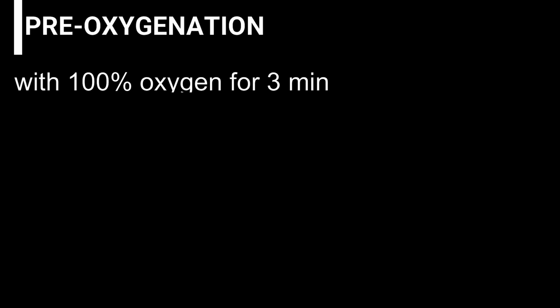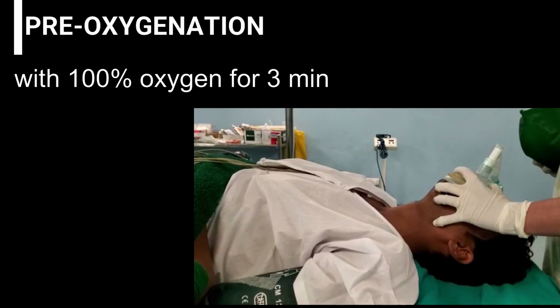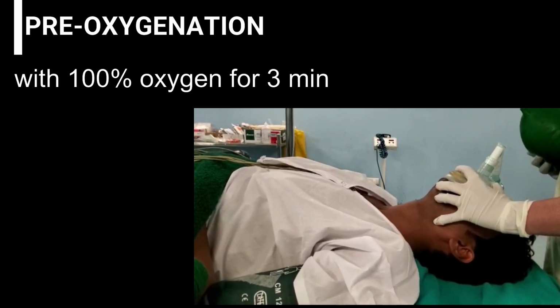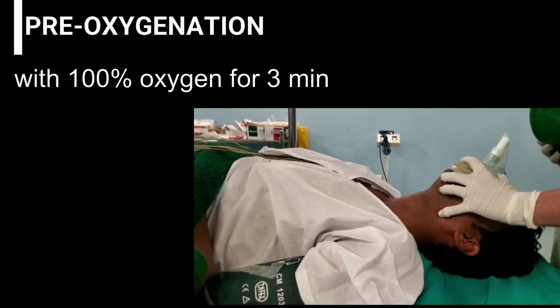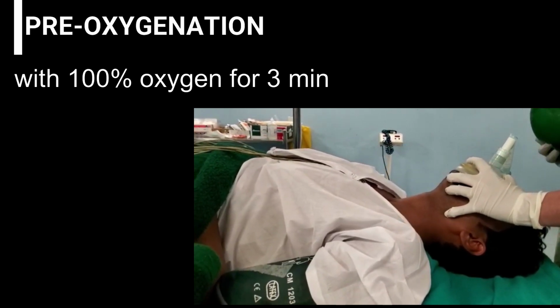Pre-oxygenation with 100% oxygen for 3 minutes, and the patient should be given enough anesthesia using an IV inducing agent and muscle relaxant. The patient should be in the standard head and neck position, that is, cervical flexion and extension of the atlanto-occipital joint.